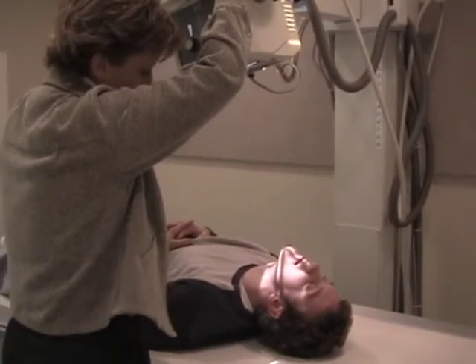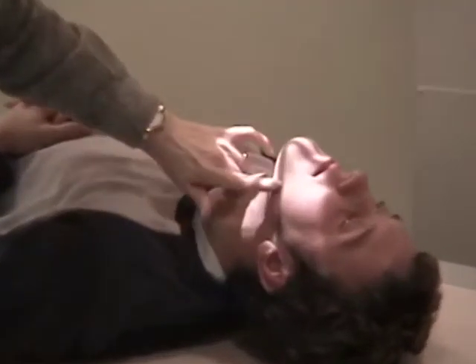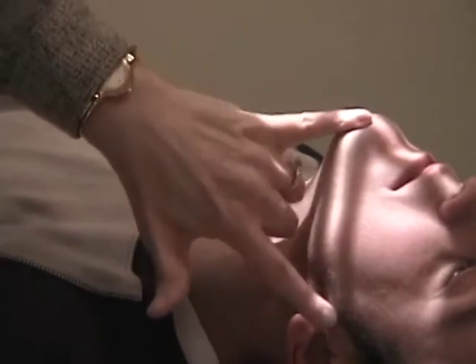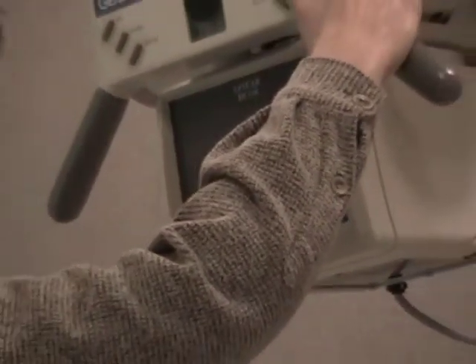And to make sure that I've angled correctly, I'm just looking at the black line matching the mental meatal line. Here's the mental meatal line, and see how I now have that black line parallel. Then I would adjust my SID for the amount of tube angle that I have, which is 10 degrees in this scenario. Come down to 38 on the gauge to maintain the 40.